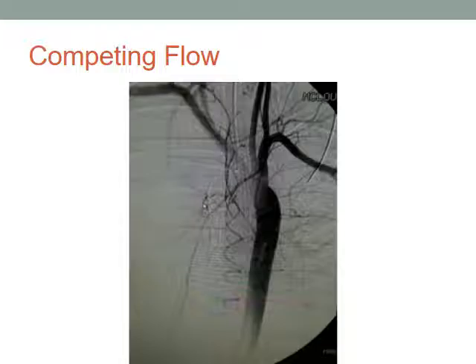Now, if I turn the ECMO flow down, what would happen? This would go further down that way, and maybe the breakpoint would be here. If I turn the ECMO flow up, it might be further back that way. If I change the blood pressure, that will change. If I lower the MAP, then the LV will eject more. If I raise the MAP, the LV will eject less. This breakpoint is going to change. And depending on where that breakpoint is, my right-sided pulse oximeter may show that the patient is having blood coming from here, from his heart, rather than from the ECMO circuit.